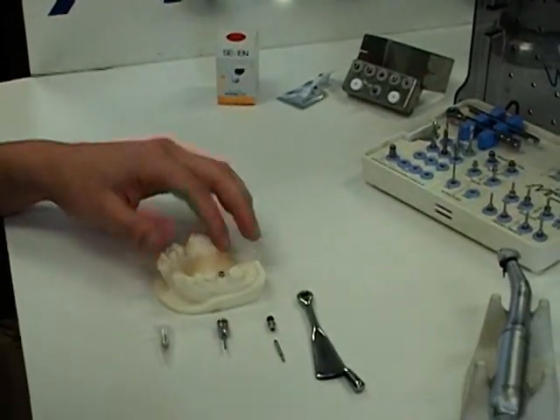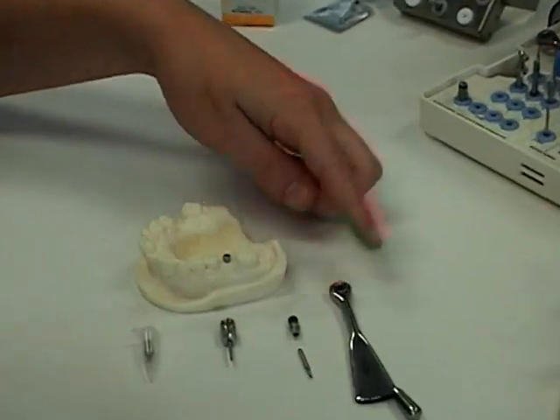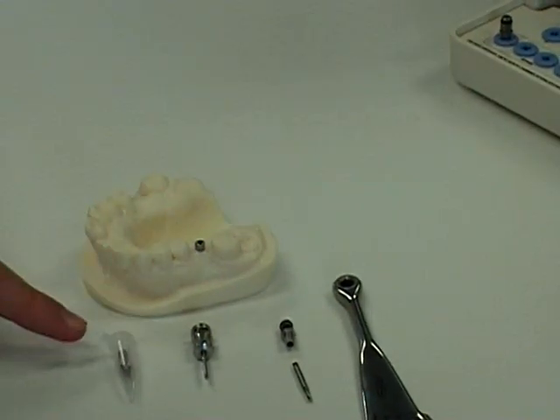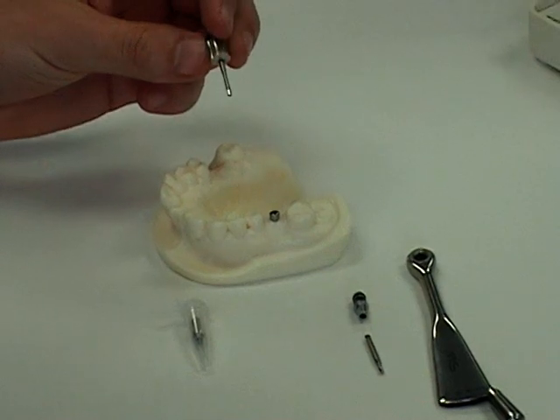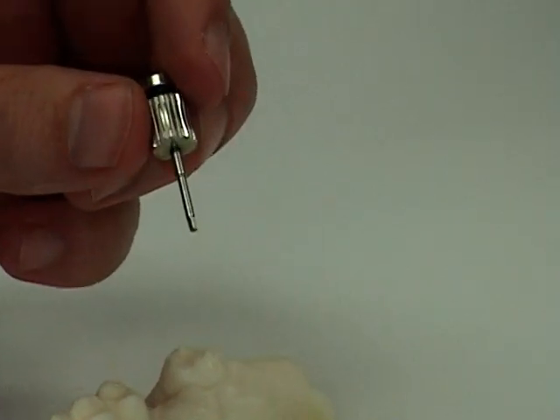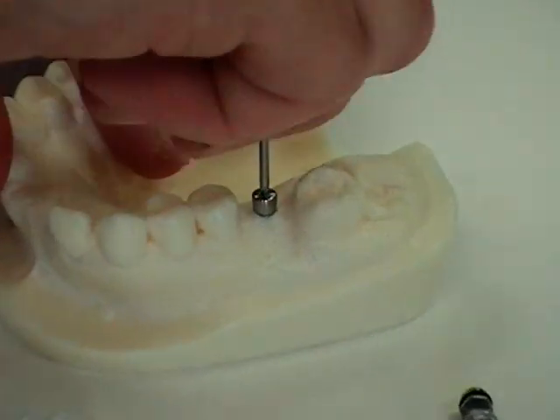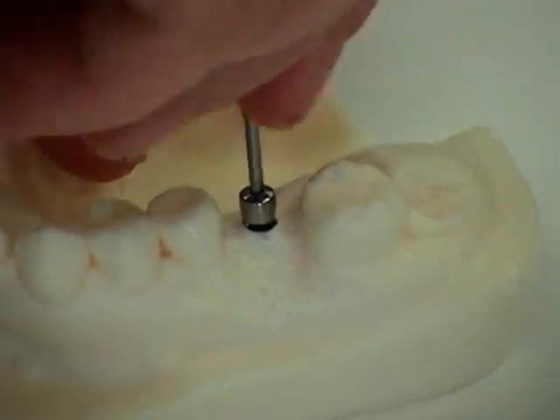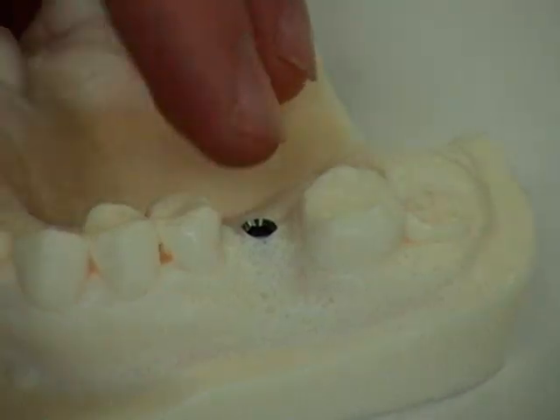What we'll be doing now is removing a healing cap with a hex driver and then using a MIS torque wrench to insert the abutments. The hex driver is a 0.05 inch hex, also called 1.25 millimeter. I'm going to put that in here, exposing the implants.